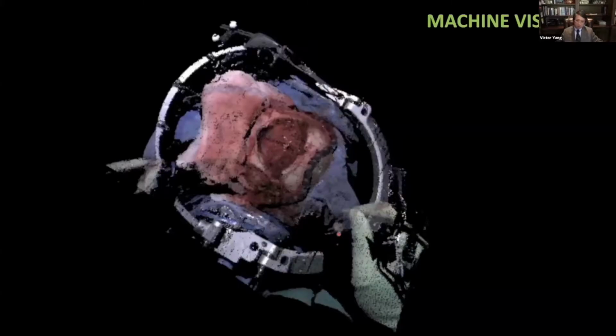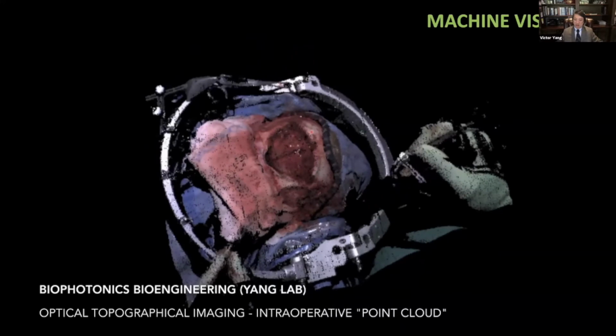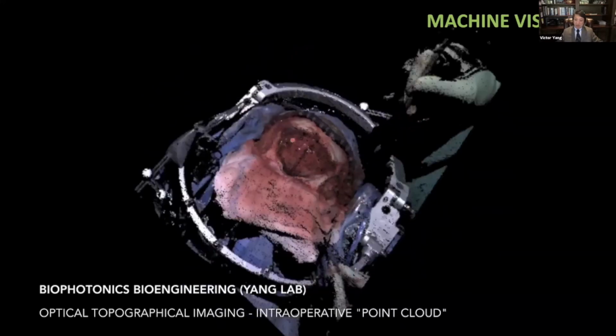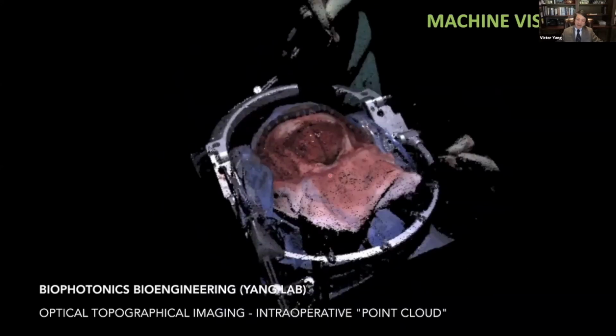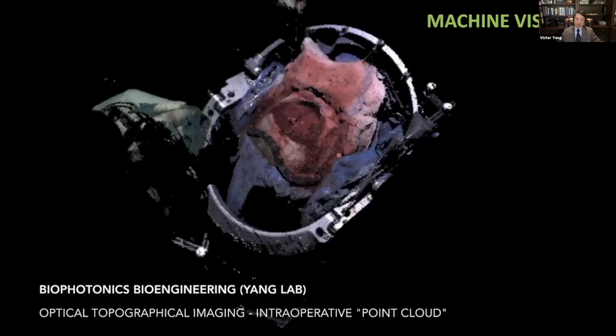I just want to drive the point home that this is a picture taken intraoperatively for an anterior craniofacial skull-based tumor resection. And this is the entire view coming from the camera system hidden within the surgical head, almost coming from a God's view, so to speak. And that God's view is 3D. So each pixel that's acquired by that God's view has about 0.3 millimeter inaccuracy, and is taken, as Bo told you, within 0.3 seconds.